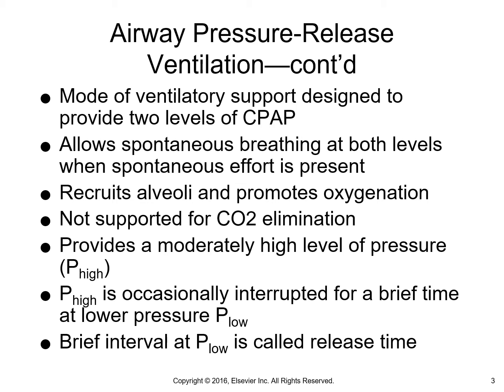The time where you come off of the P high is called your release time. Then you also set a time high and a time low, but we'll get into more details as we go on.